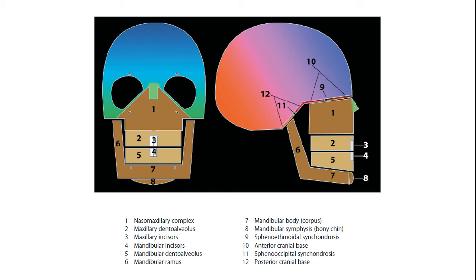It is important to examine the dentoskeletal relationships using more than one cephalometric analysis because, for structural and geometric reasons, a single measurement or analysis may be misleading. The assessment of the dentoskeletal relationships should be undertaken using analyses, and thereby measurements, that are based on different reference planes. For example, the use of SNA and SNB angles to assess the sagittal position of the jaws may be misleading because of the variation in the orientation of the SN plane.